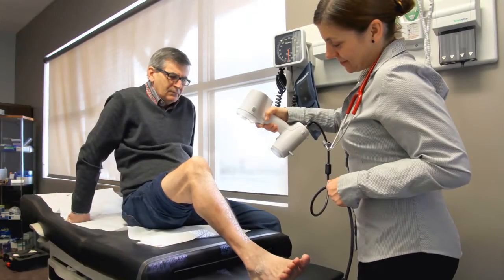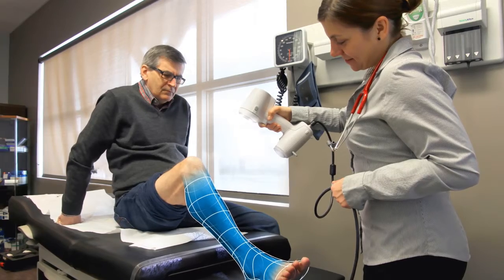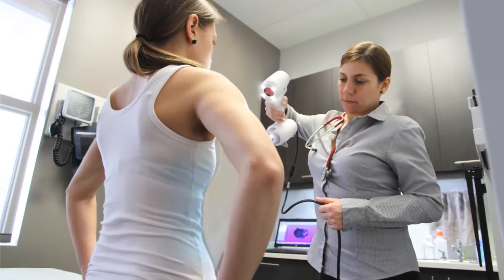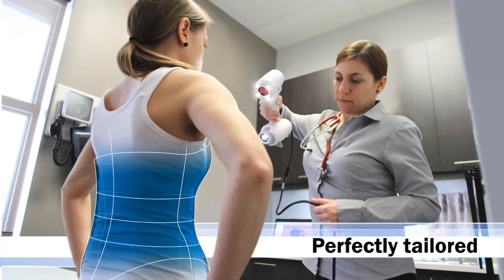In just a few seconds, the scanner generates 3D files that can be used to manufacture customized orthosis, prosthesis, and other healthcare accessories perfectly tailored to the patient's body.